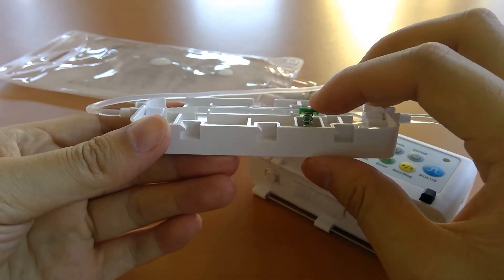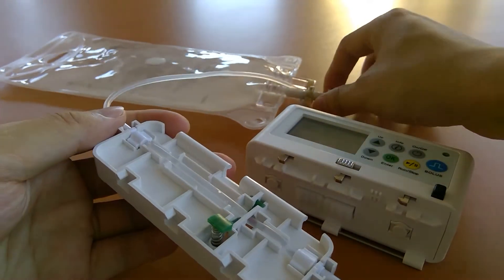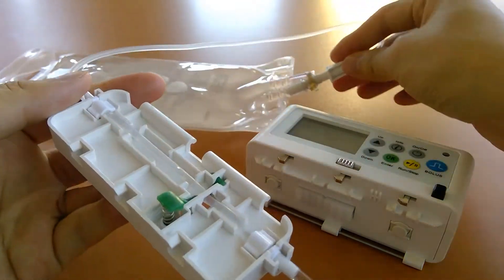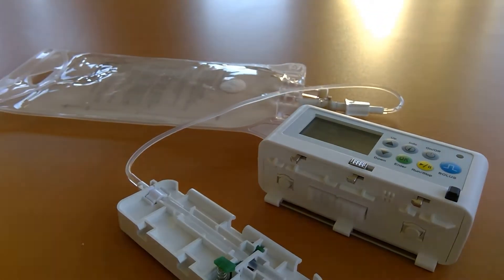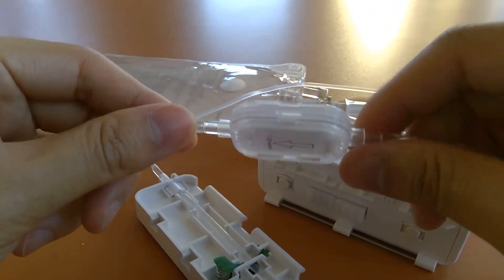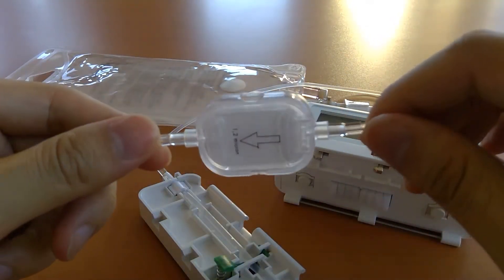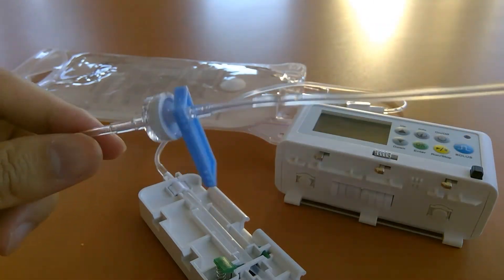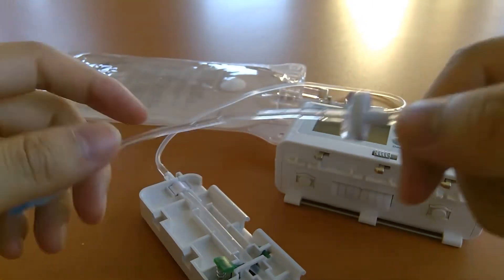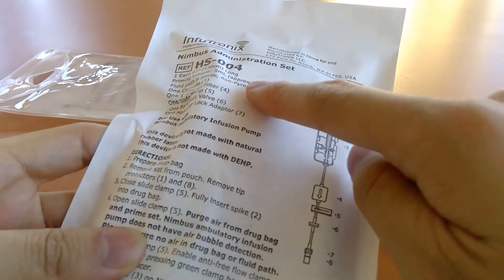The set has an anti-free flow clamp that pinches off the flow. Components of the cassette include a bag spike — you can spike any medication bag. Moving down the tubing there's an air eliminating filter, so the pump itself doesn't have an air-in-line sensor but the air eliminating filter gets rid of all bubbles. There's also a slide clamp, a back check valve, and a luer lock at the end. That is our HS004 configuration.